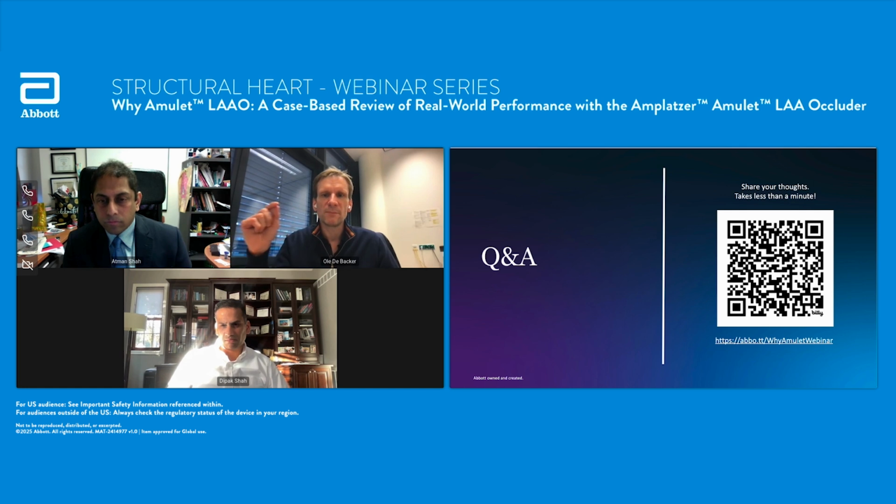So if you can do MPR, multiplane reconstruction imaging of your appendage, then you can really do accurate sizing, which you cannot do with 2-dimensional ICE. So the advantage of 3D ICE is that you don't even need 3D imaging pre-procedurally. You can do all your sizing and your guidance of your procedure intra-procedurally.